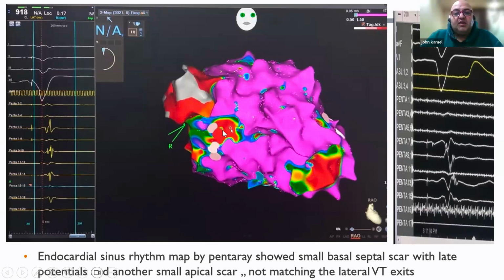I guess this is the reason for the complication of heart block in his native country. I guess the operator, when doing the endocardial LV voltage map, found such basal fractionation and basal scarring at the level of the His, started to ablate in such an area, and caused complete heart block.